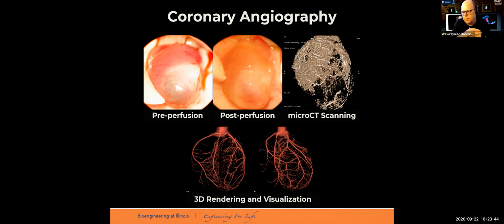This was one of the best images that I acquired in my life, using a very small object like a mouse, which was injected with a contrast agent, creating those spectacular images where you can really look at the vascular branches.